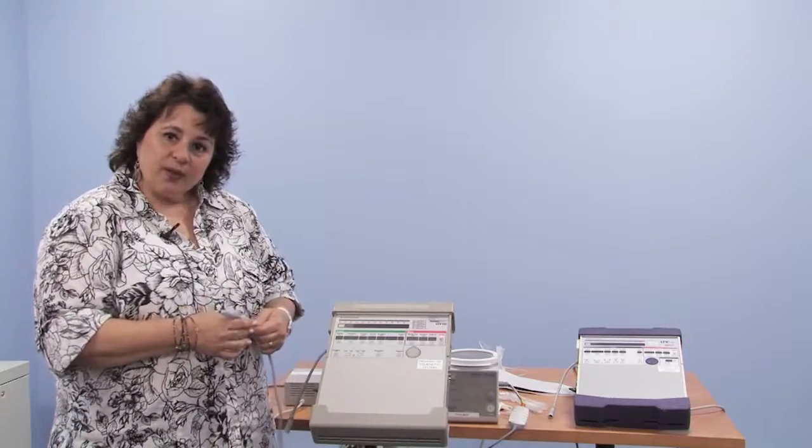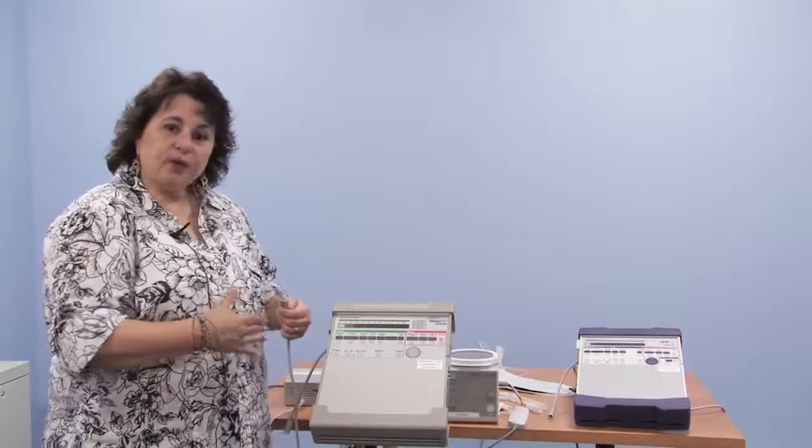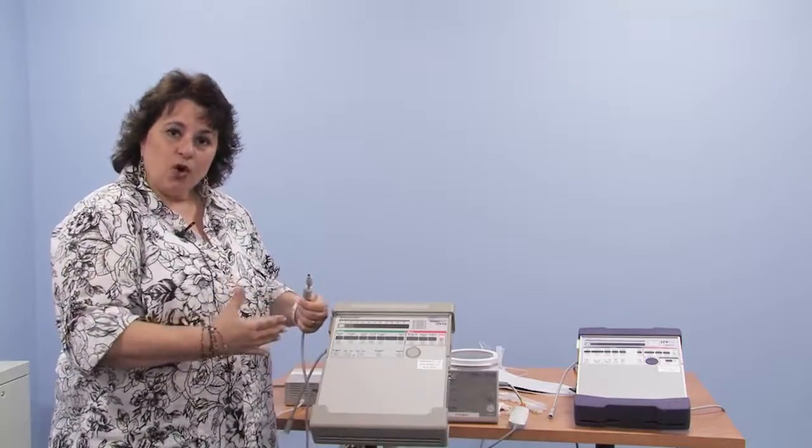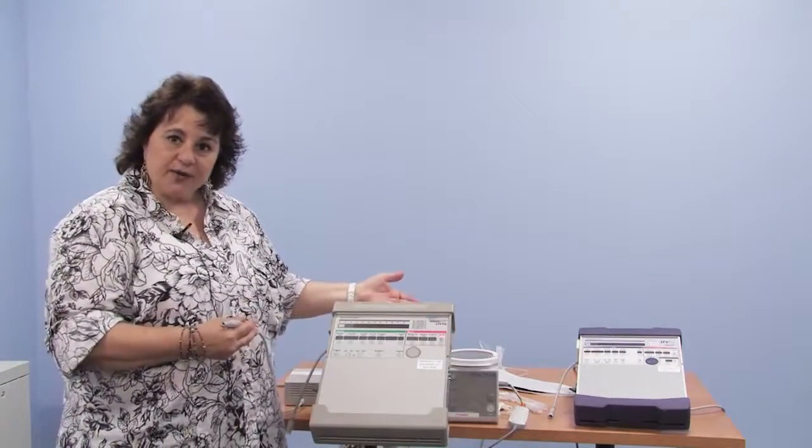What we're going to do now is set up the LTV 950 with its circuitry for pediatric in-the-home ventilation with heated humidification and heated wires. There's a variety of circuits for the LTV, pediatric and adult size. There is not a neonatal size. So for those of you that are taking home children from the nursery, you will be surprised a little bit at the size and weight of the hoses as compared to the ventilator hoses that you've seen in the neonatal ICU. But that is what's available for this device.